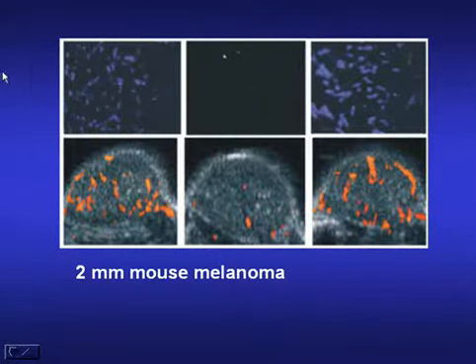Now, there's a large number of different research opportunities with ultrasound contrast, particularly when we're trying to study animal models. And one of the properties of ultrasound is that it can be scaled up or down very effectively in a way that is more difficult to do with CT or MRI. In our small animal imaging laboratories, we do have micro CT and micro MR scanners for studying small animal models, but these are extremely expensive. Ultrasound can be scaled down by increasing frequencies and by building special transducers.